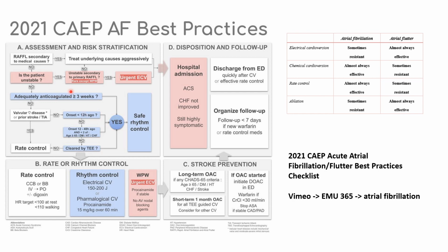Here, I just wanted to point out that it's important when you go into all tachycardias to think, are they secondary or primary? And we already talked about how to distinguish the primary and secondary, but this is the algorithm where they actually talk about it. Okay.